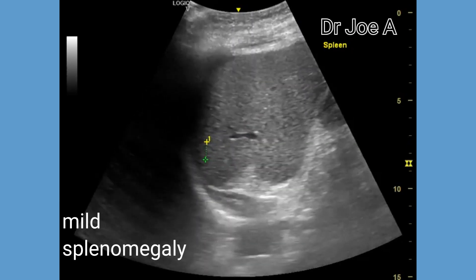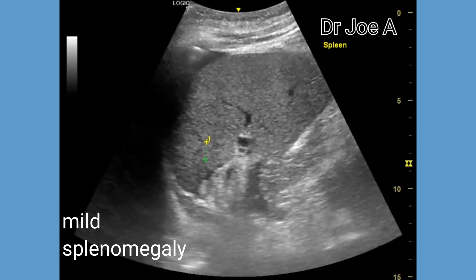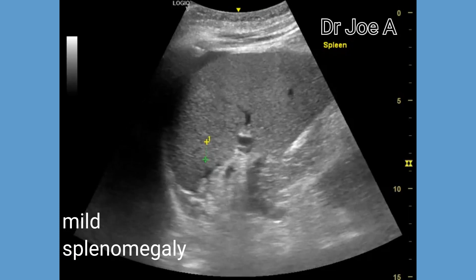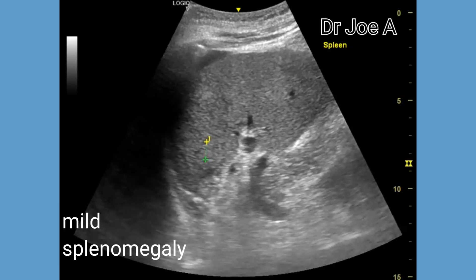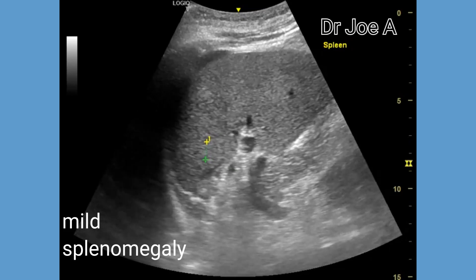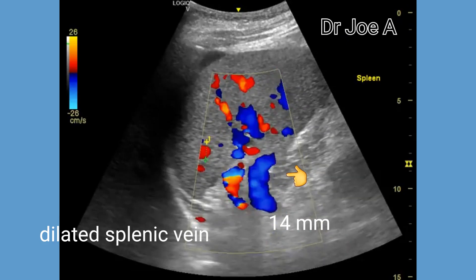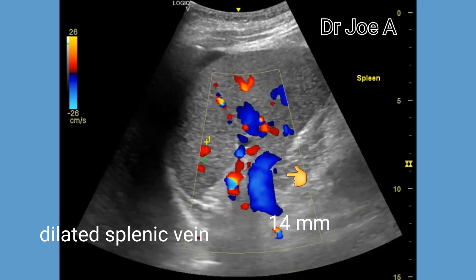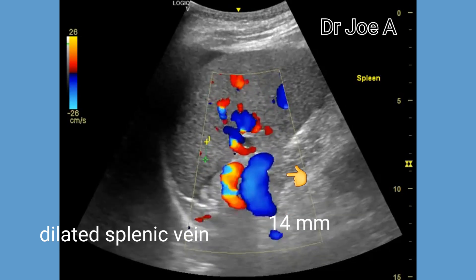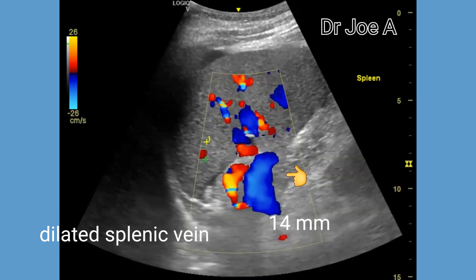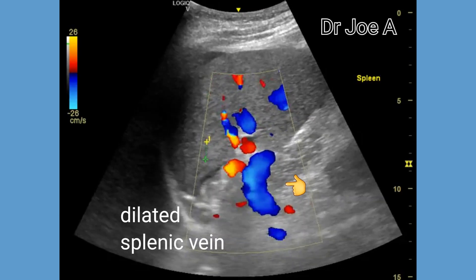Let's have a look at the splenic vein. On color Doppler, the splenic vein measures 14 millimeters in diameter, which is grossly abnormal. Moderate dilation of the splenic vein suggests evidence of portal hypertension.